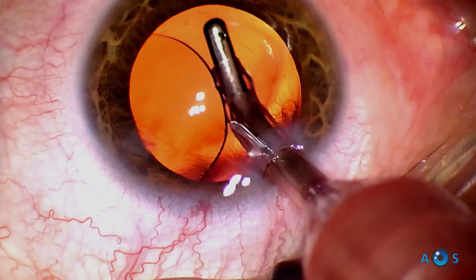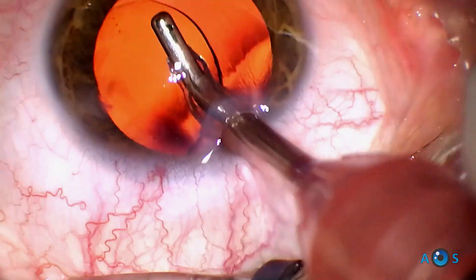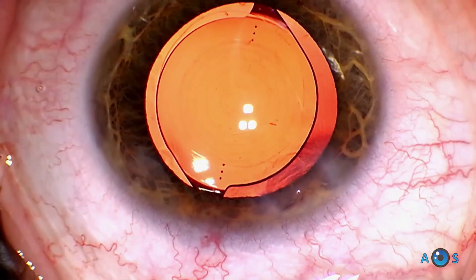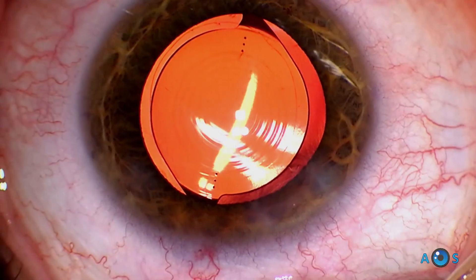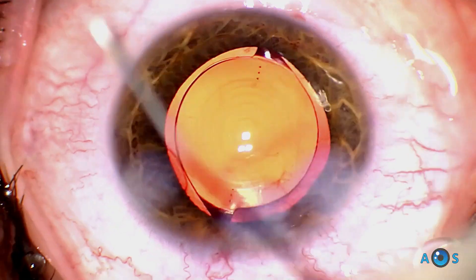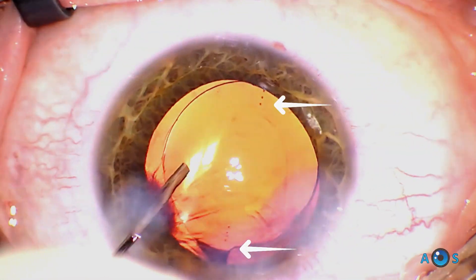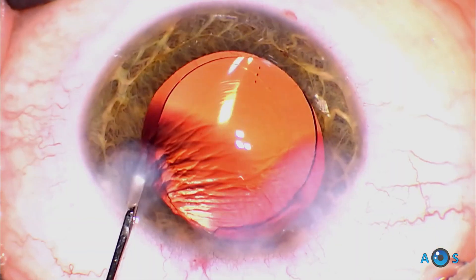This lens is based on a quadrifocal design in which one of the foci was modified and directed towards distance vision, while the intermediate focus is adjusted to about 60 cm, perhaps being more suitable for intensive computer use. There is also a near focal point provided by an add power of 3.25 diopters, corresponding to about 40 cm distance vision. This is a toric model, so when the surgery is complete we must fine-tune the final position of the lens to ensure the toric markers are aligned in the intended axis.